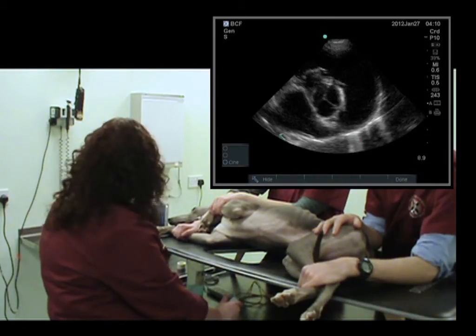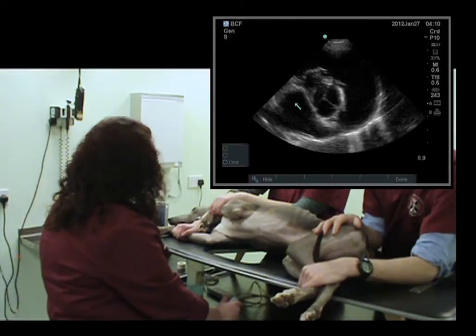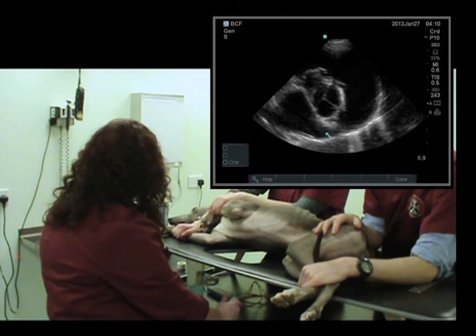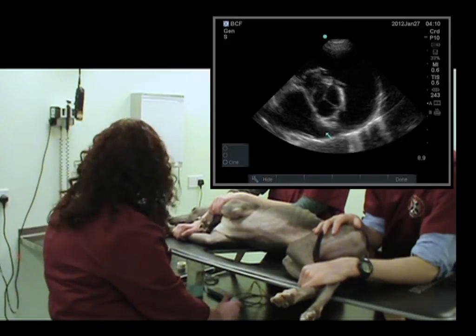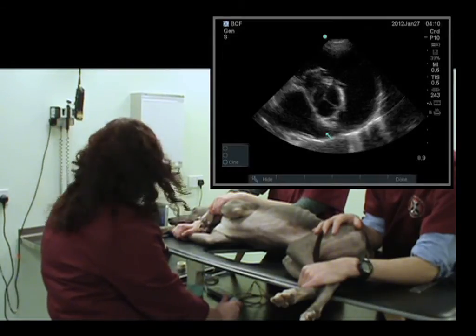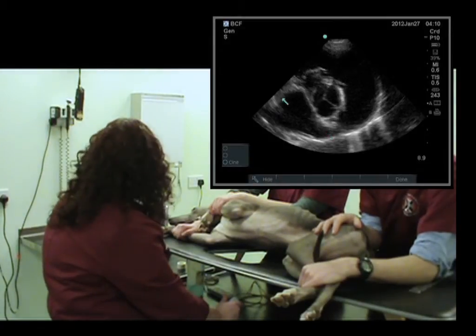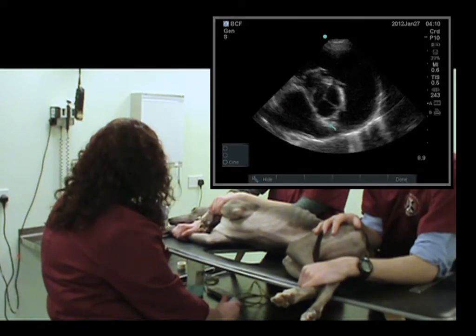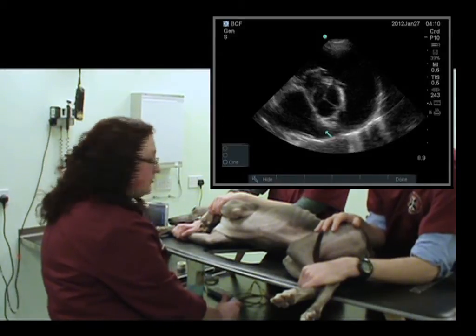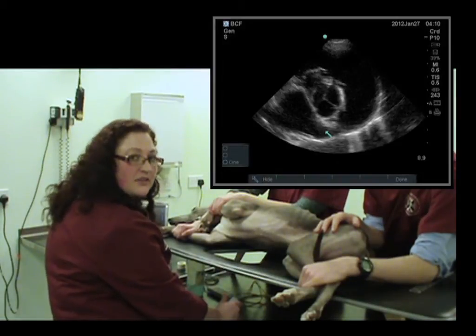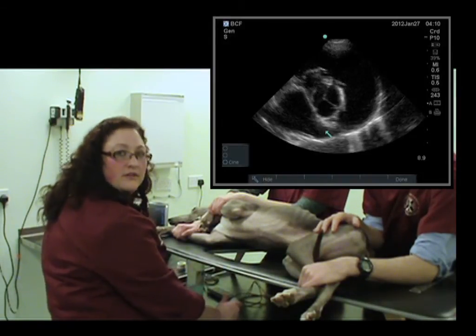In this particular view, this is the left atrium, and this is the left atrial appendage, or the auricle. This should normally appear as a comma shape, as is seen here. We have the left atrium going down into a comma shape into the left atrial appendage, which indicates that the left atrium is a normal size and shape.